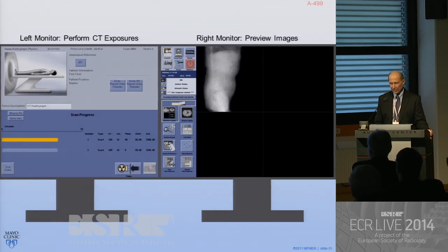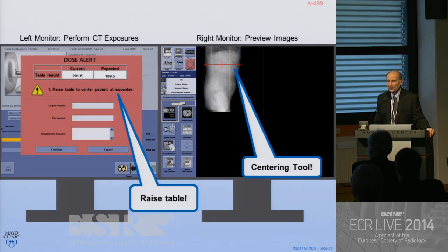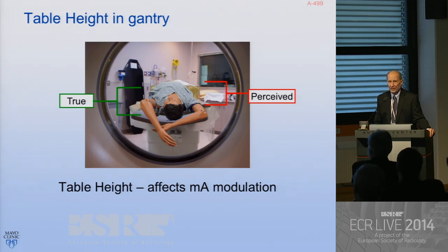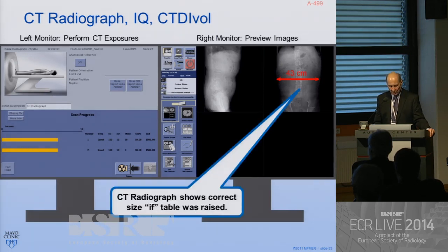So we take our lateral projection, and we notice immediately that the patient's a little bit low in the gantry, right? So wouldn't it be nice, you see that little line there, if we had a tool? This tool does not exist, but if we had it, we could know immediately that the patient's a little bit lower. And we all know that if you get the center of the anatomy in the center of the image, you're going to get a better quality image, right? And because the tube current modulation varies as a function of where the anatomy is located, you may also save some radiation dose. So we could, if we had it, have a new pop-up screen that says, do you really want to move that patient? And here's how much you need to move it. And so you could run into the room and raise the patient up a little bit and achieve a better set of data for your tube current modulation.